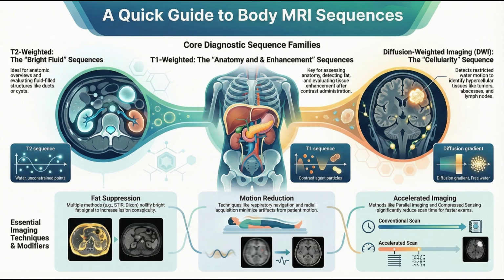That's the magic. This highly undersampled data gets fed into a very sophisticated denoising algorithm. It's kind of like taking a few random puzzle pieces and letting an AI figure out the rest of the picture with stunning accuracy. It just markedly reduces your acquisition time.